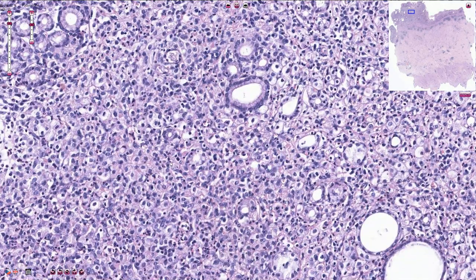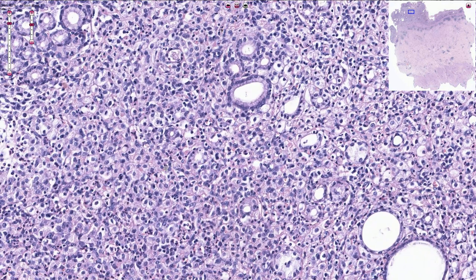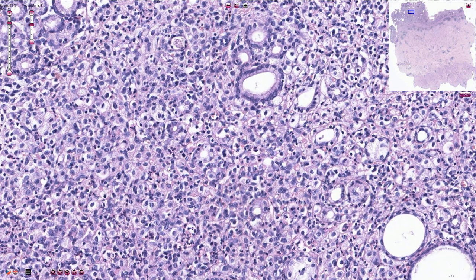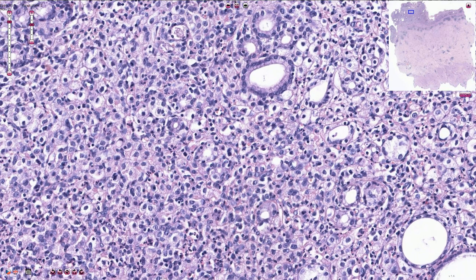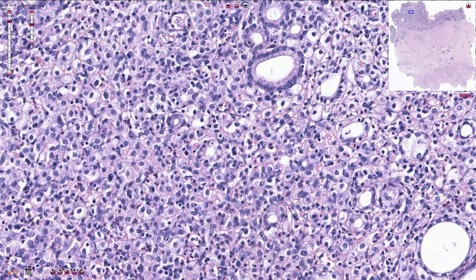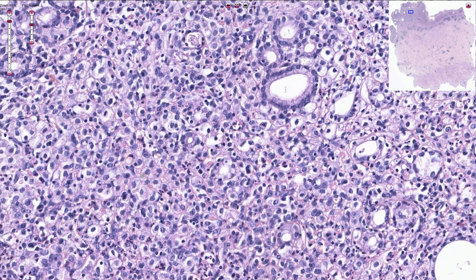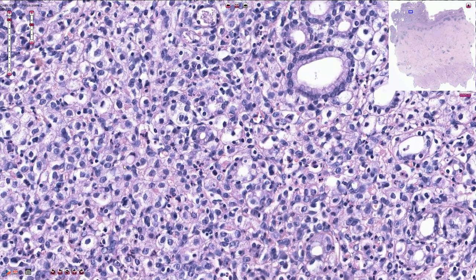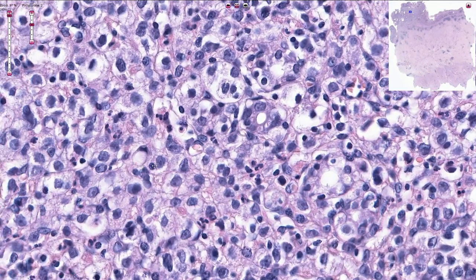Most of these cells resemble histiocytes, so this is an example of the histiocytic variant of the poorly cohesive gastric adenocarcinoma, which is not really important for the patient. The cells have quite voluminous clear cytoplasm filled with mucin, and we can also find a few typical signet ring cells.